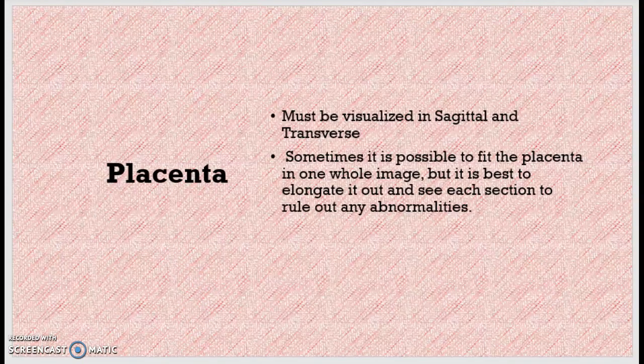Now we're at the placenta. The placenta must be visualized in sagittal and transverse. Sometimes it is possible to fit the placenta in one whole image, but it is best to elongate it out and see each section to rule out any abnormalities.